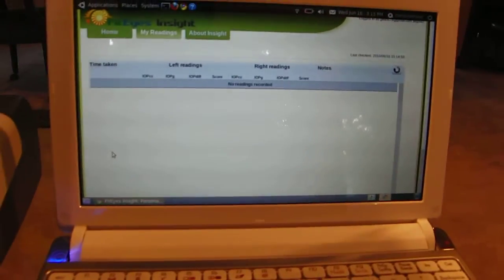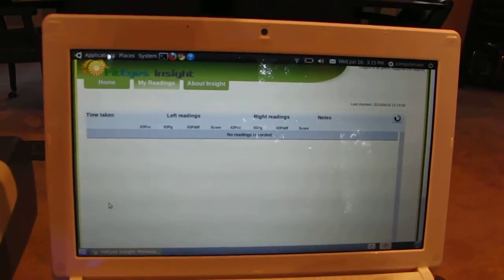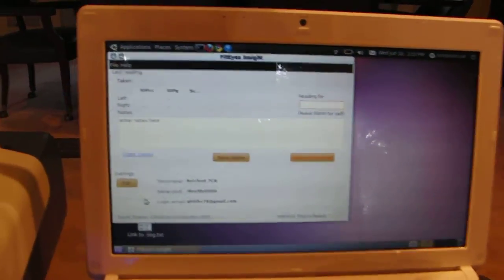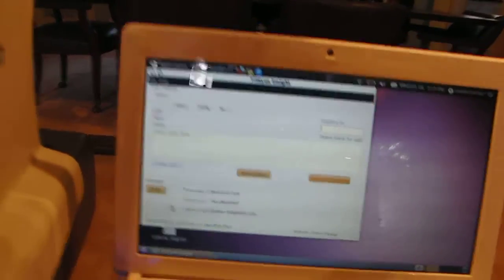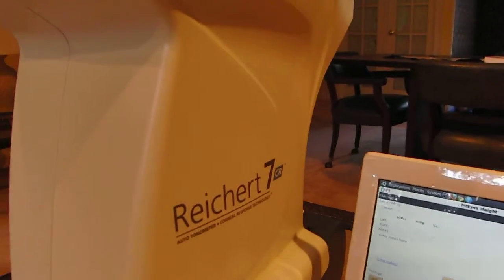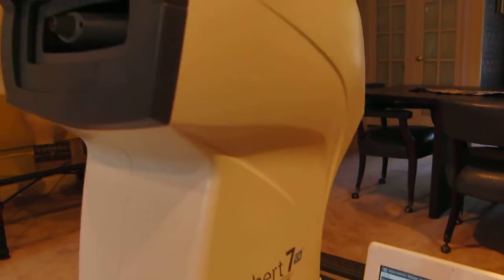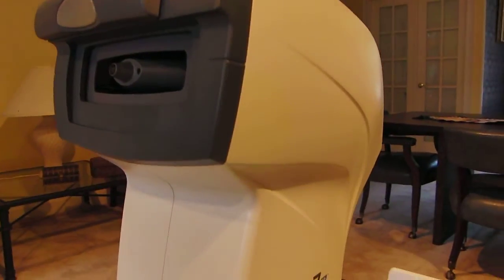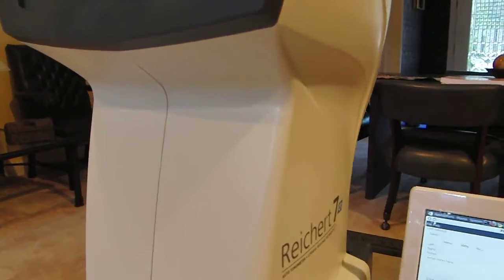We'll let you see how all this works. So here's the application. Now in addition to doing self-tonometry, we're doing self-video. So let's give this a try, see how well we can do it.